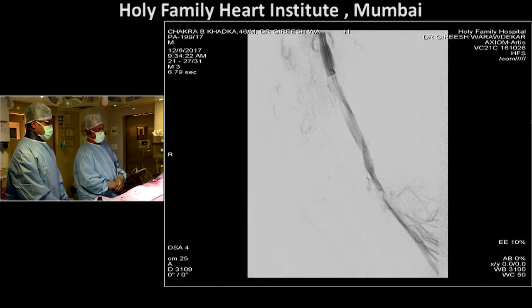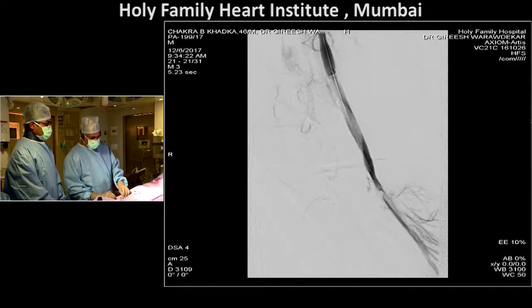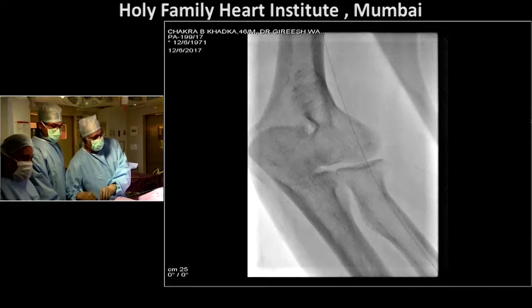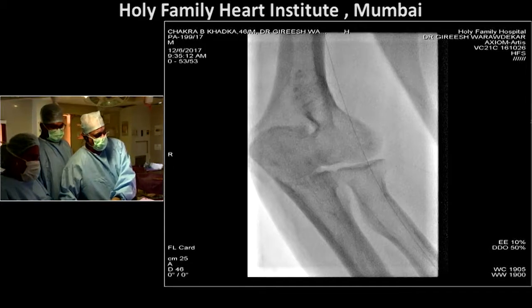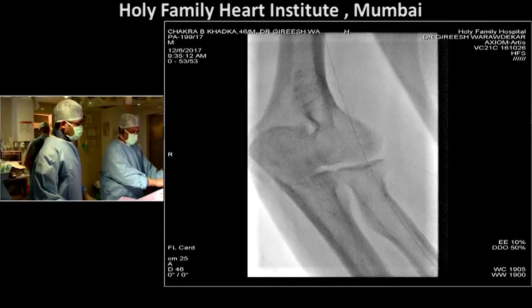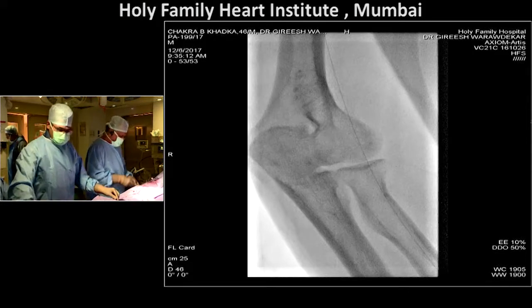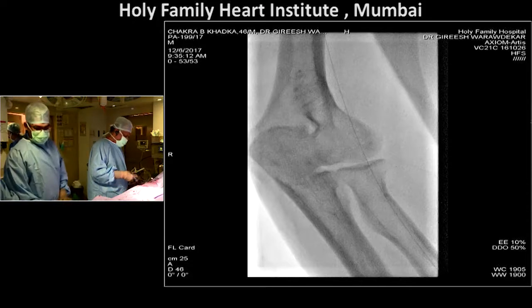I think we'll just take one last run through. Do you use specialty balloons like Angiosculpt or chocolate balloon? Somebody was asking. No, we unfortunately don't have either. Angiosculpt, I think we have, but those are for the coronaries. But chocolate balloon, definitely we don't have. Nicorandil, NTG. So again, I think vasodilatation should be attempted. And then we take a run there. The last run, yes.